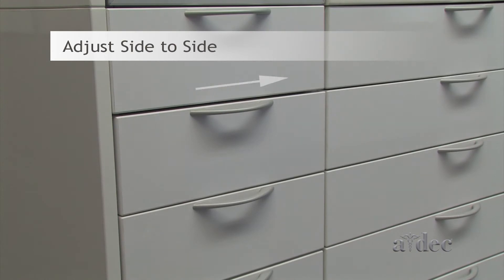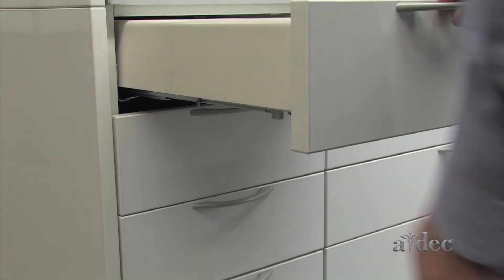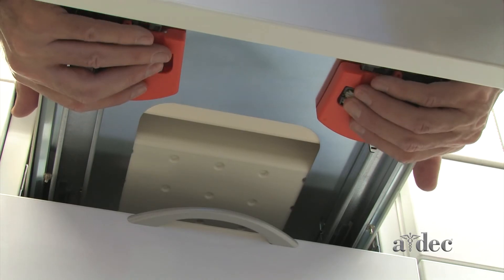To adjust the drawer face side to side, rotate the barrels in the direction you want the drawer face to move.